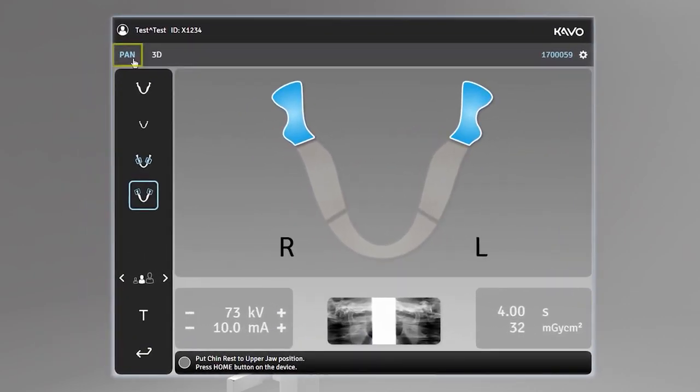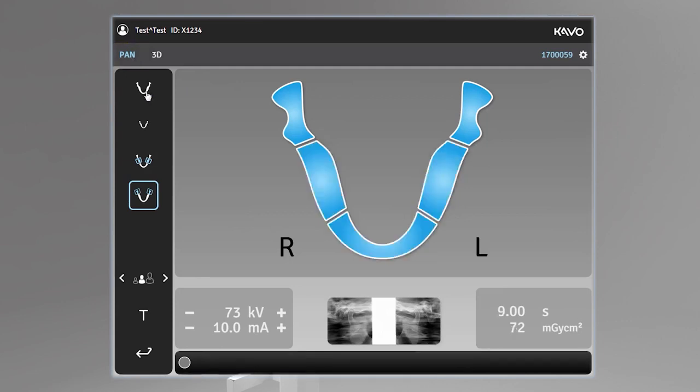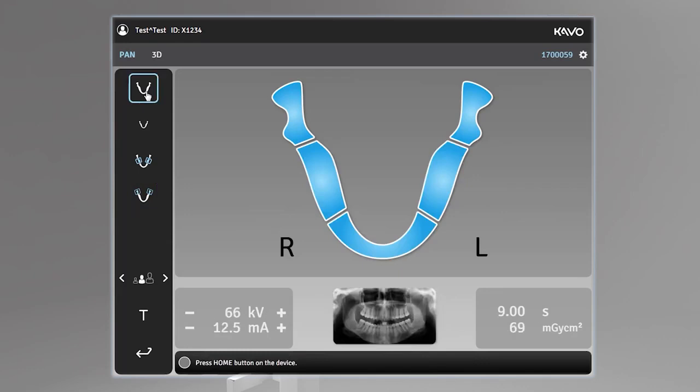Select the panoramic tab. With the panoramic imaging program selected, you can select the imaging modality. Press the imaging program icons to change the active imaging program.